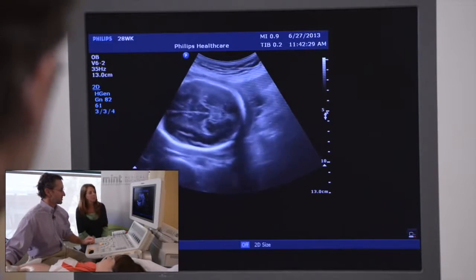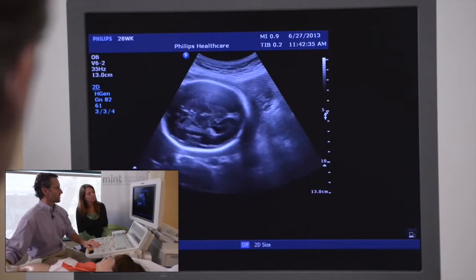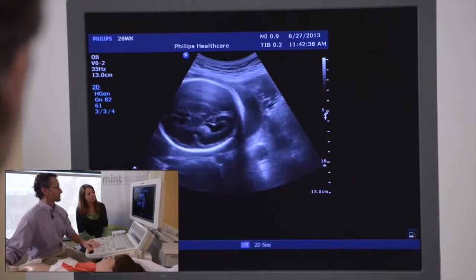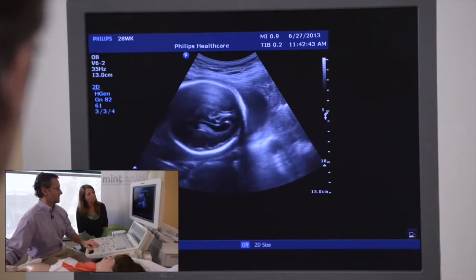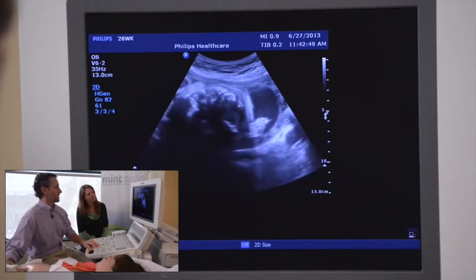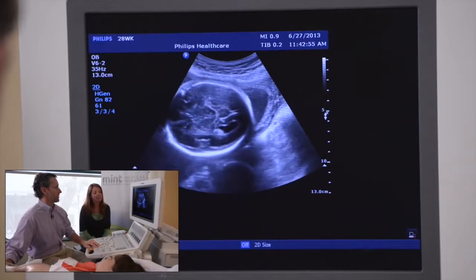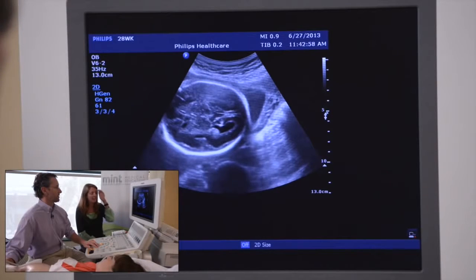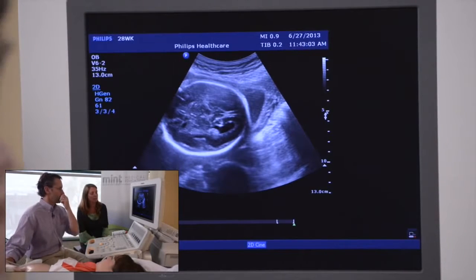And then the lateral ventricle is the last thing we want to see. And we want to line it up so that the choroid, which is that bright structure inside, is visible. The downside anatomy of the brain is always a little bit easier to see than the anterior superficial side, just due to the proximity of the skull. So you get that anterior artifact of the reverberation.